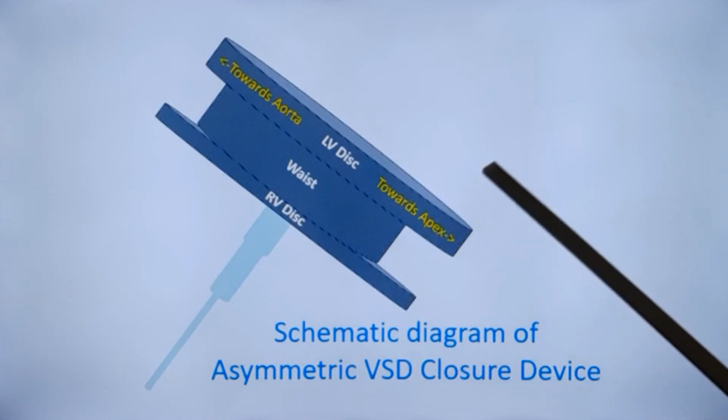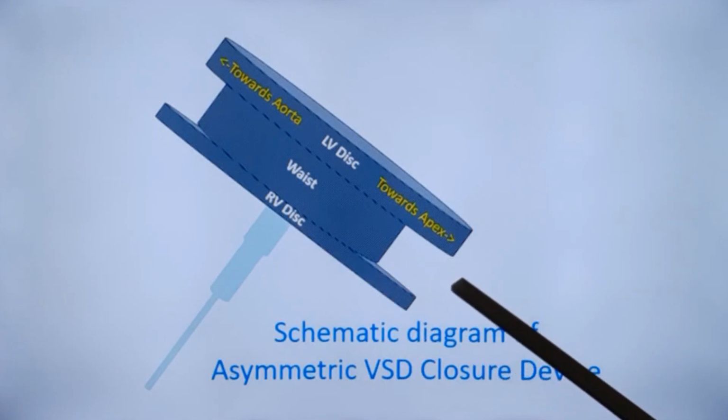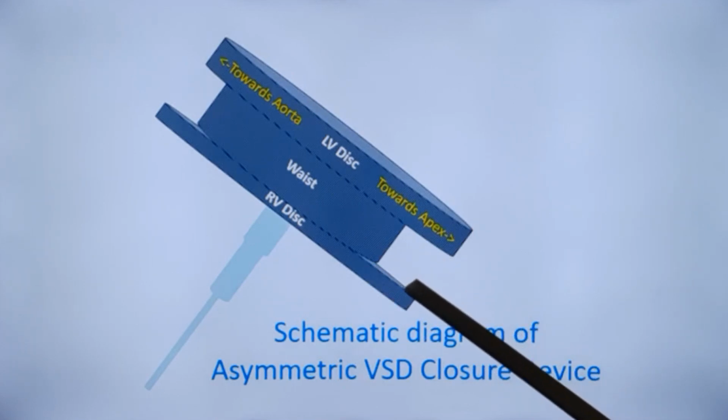This has been used in several reports and with reasonable results, though even now it is still an off-label use of the device. The right ventricular disc is 4 mm larger than the waist. The asymmetric VSD closure device is made of nitinol mesh covered with dacron fabric to facilitate thrombogenesis, so that the final occlusion of the defect is by thrombus formation in the mesh.